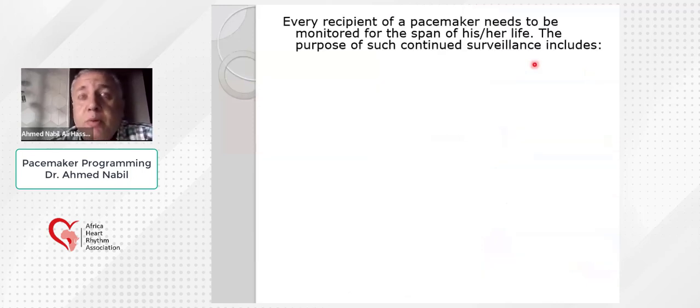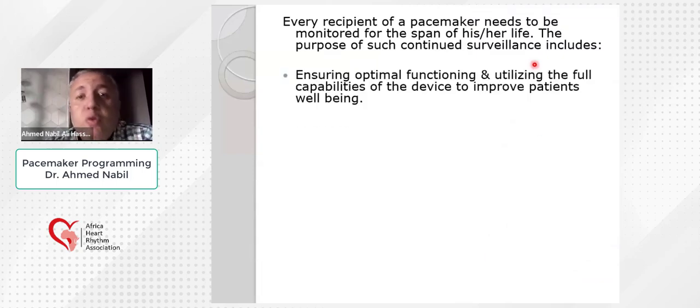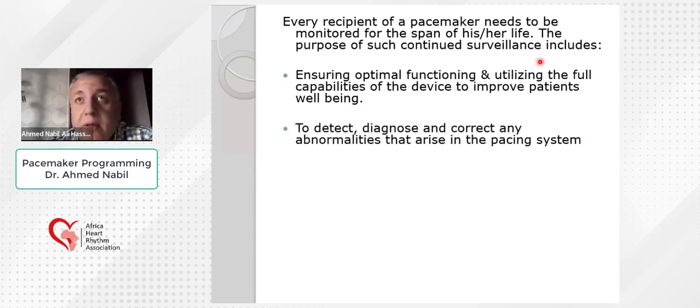If we talk about programming, we have certain goals that we need to achieve. We do programming for the following goals. First, we should ensure that this pacemaker is functioning optimally, that it is utilizing the full capabilities of the device, and this is targeting improving the patient's well-being.